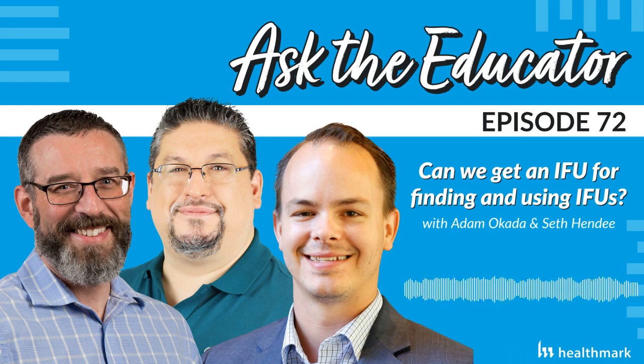That wraps up our IFU discussion with Adam Okada and Seth Hendee. Just to recap this episode, we want to make sure that our listeners understand it is no longer good enough to have access to current IFUs for all equipment and instruments. You and your SPD technicians need to have the ability to open, navigate, and find the information that matters in the IFU. We recommend that you have specific training for IFU retrieval and documented competency with return demonstration. That way, when a surveyor asks you to look up an IFU, instead of getting that sinking feeling in your stomach and that deer in the headlights look, you can find what you need with confidence.